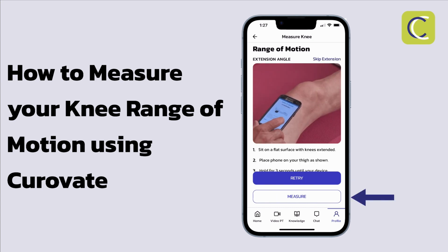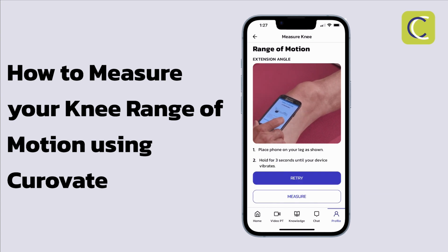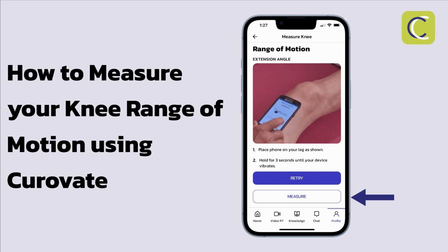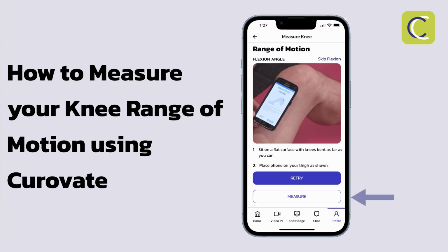Start with your leg straight with a firm towel roll underneath your ankle, and place the phone just above your knee and select Measure. Next, move the phone to just below your knee and select Measure again. You've now completed measuring your knee straightening.